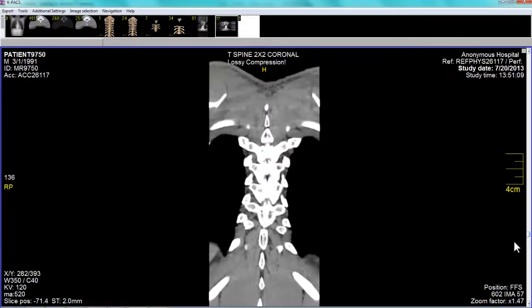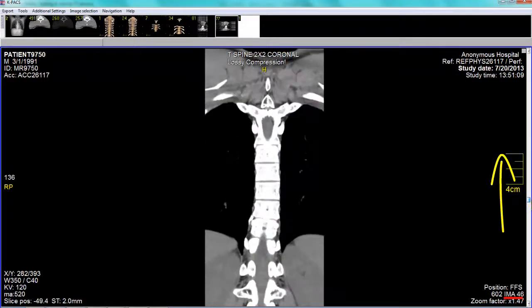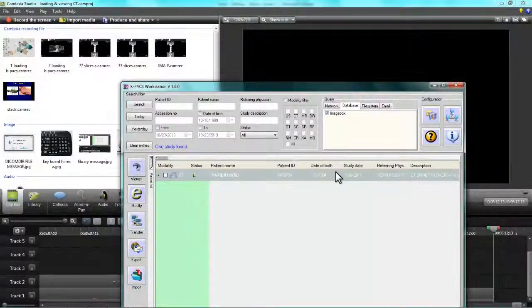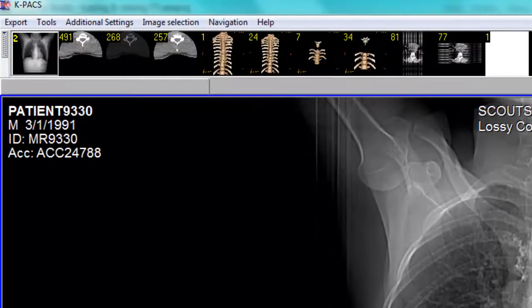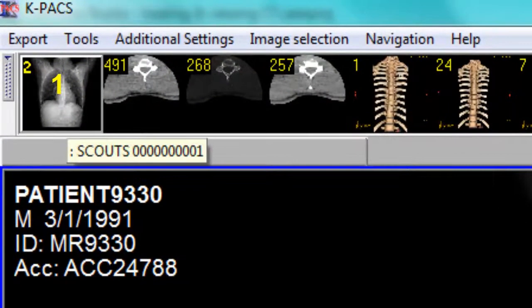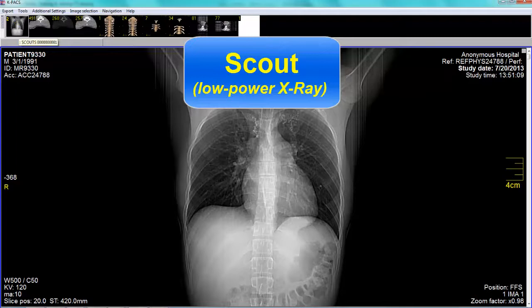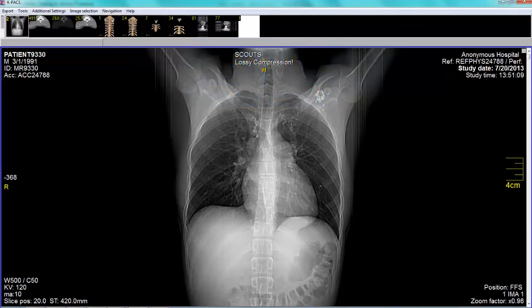I'm going to move my cursor over to the right to the scroll bar and move it up. You notice that the images get progressively smaller. I want to digress for a minute and reload the patient CTs into the computer, so I'll double-click onto the patients. The very first image in this series of 11 stacks is what we call a scout — a low-powered x-ray showing an overview of the thorax, which radiologists use to get an idea of what pathology or trauma might exist.